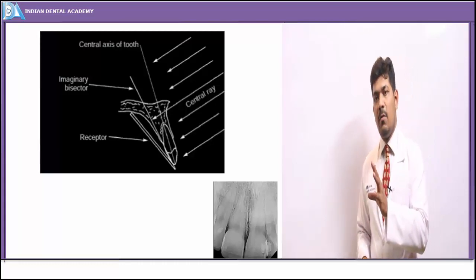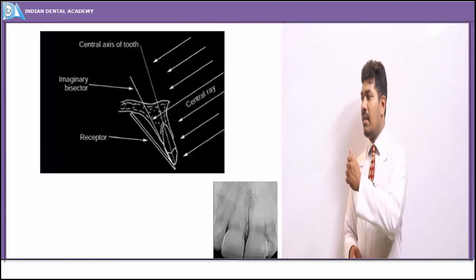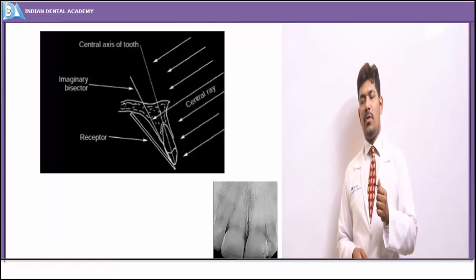So it does not give any distortion in the geometric proportions.